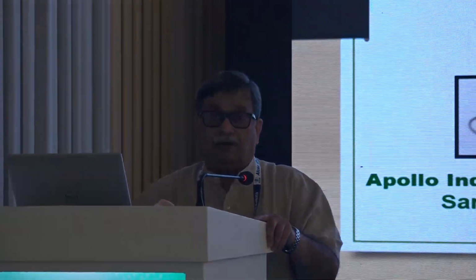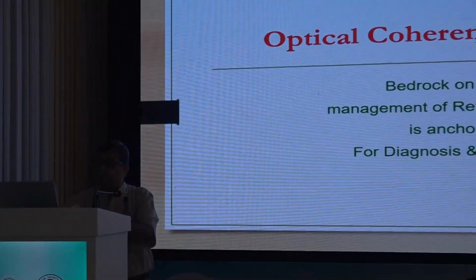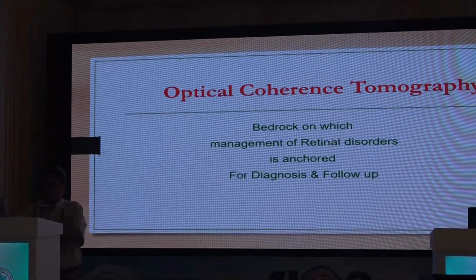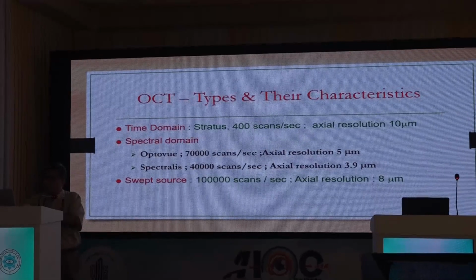So without any further ado, let's go to it. We've gone through how you use the OCT for the anterior segment and glaucoma. Now what about the retina? Well, the fact is that the OCT is the bedrock on which management of many retinal disorders is now anchored, and not only the diagnosis, but also their management and follow-up.